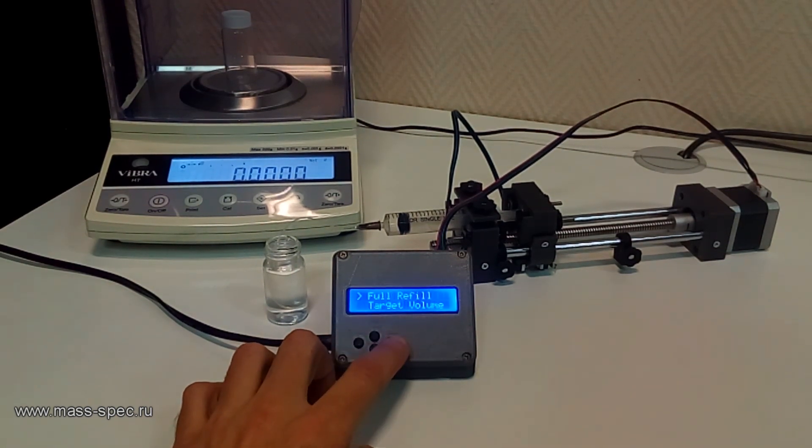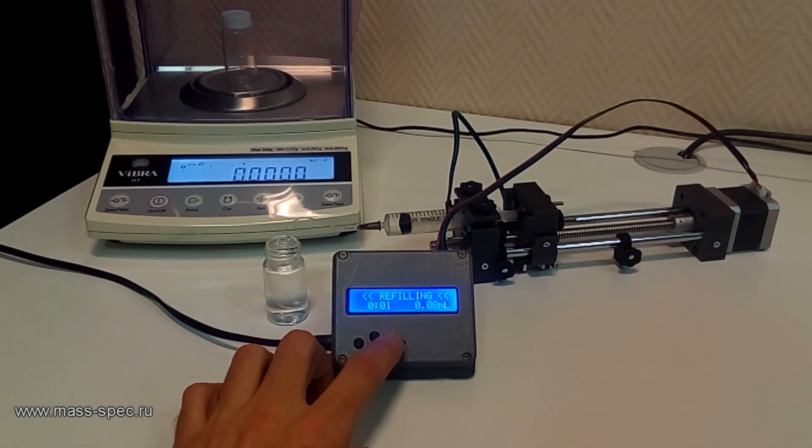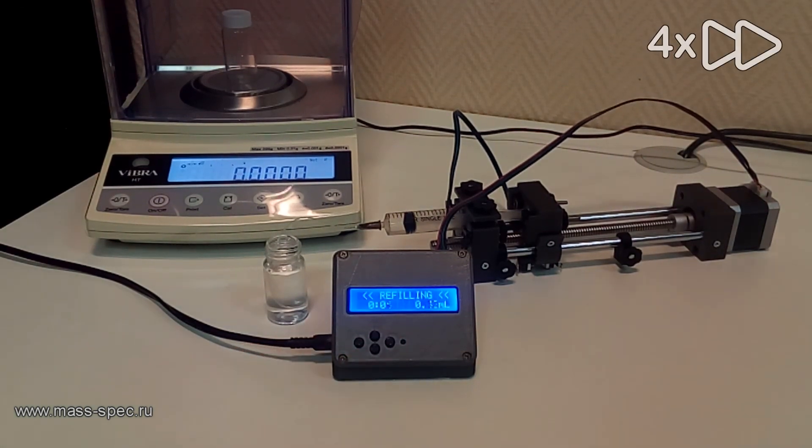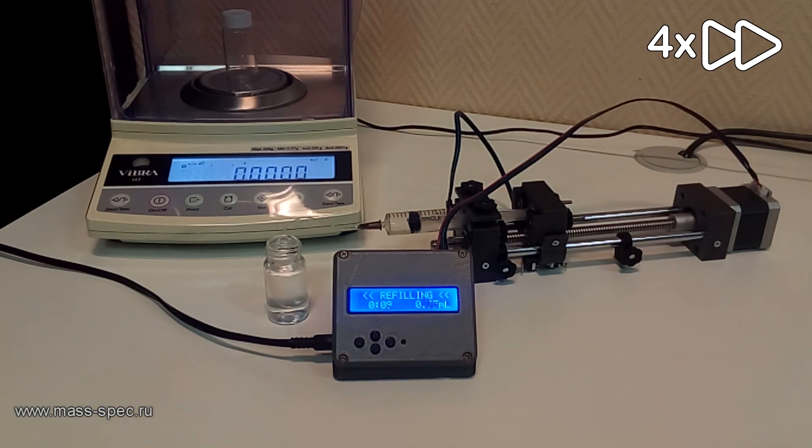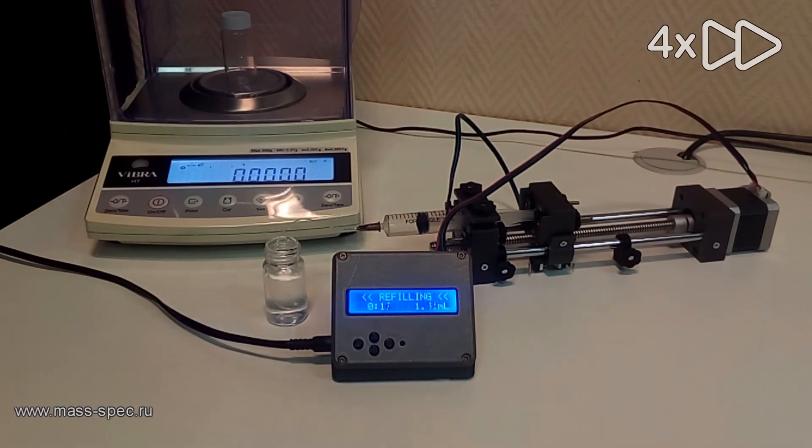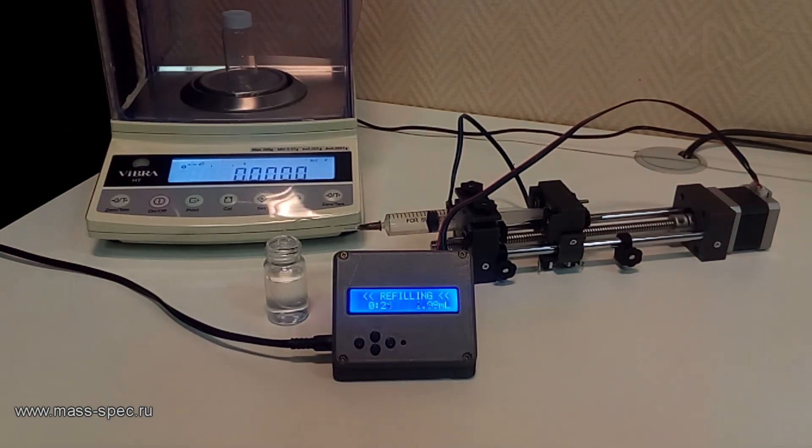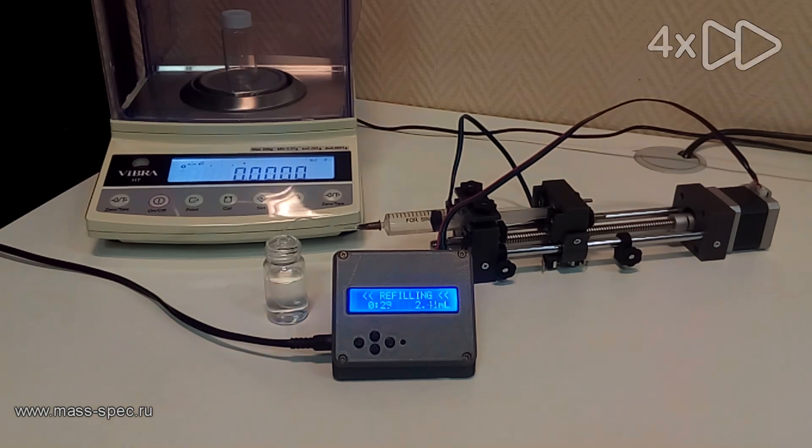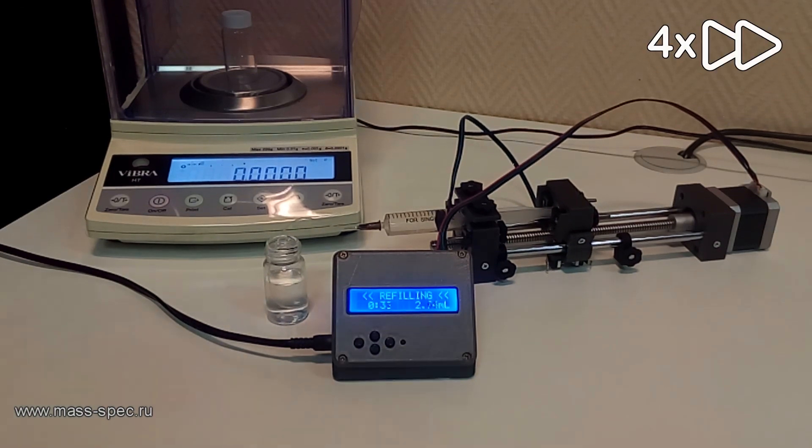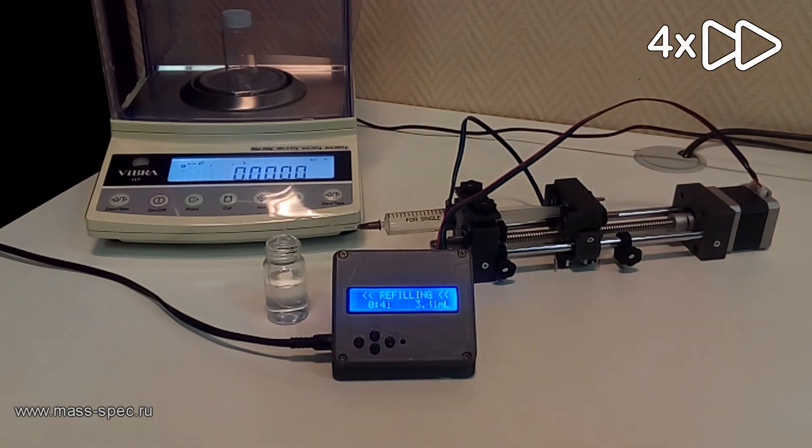The full refill option is used to completely fill the syringe. Two limit switches allow control of the carriage movement and determine the boundaries of the working area.